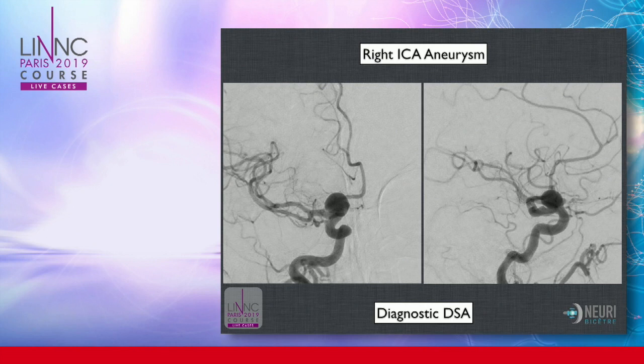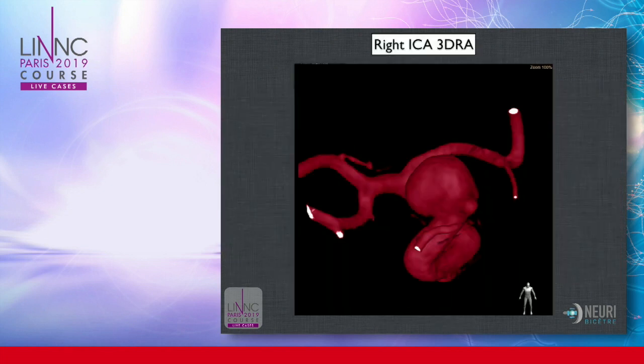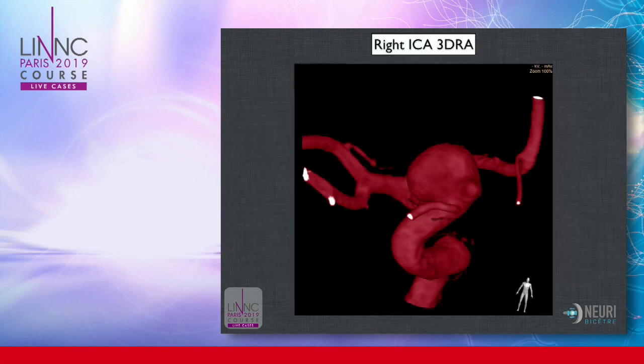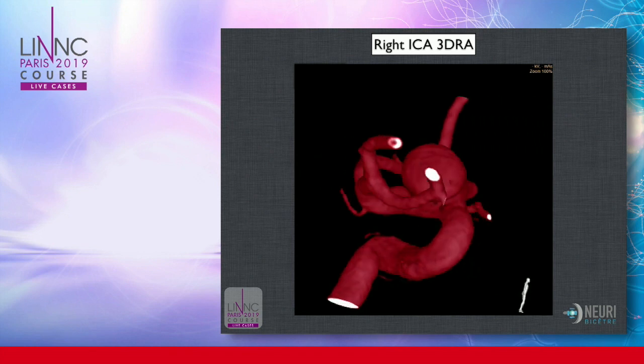So this is the angiogram that was performed. Supraclinoid carotid artery aneurysm, which has nothing specific. You will see the neck on the 3D, checking the posterior circulation, understanding the potential PCOM. Here there is no. This is the 3D pictures. You can understand the neck.